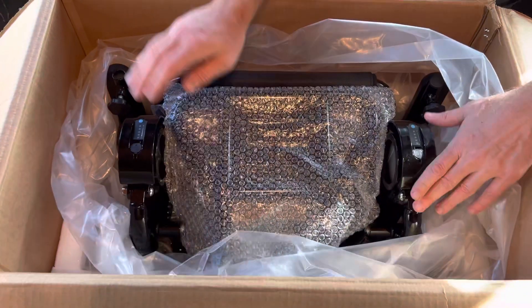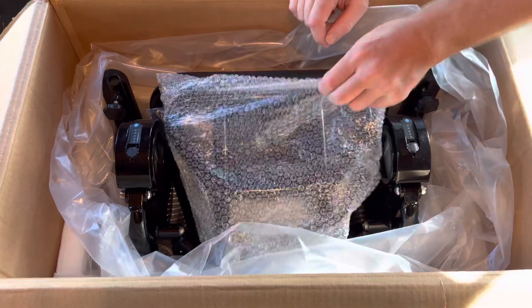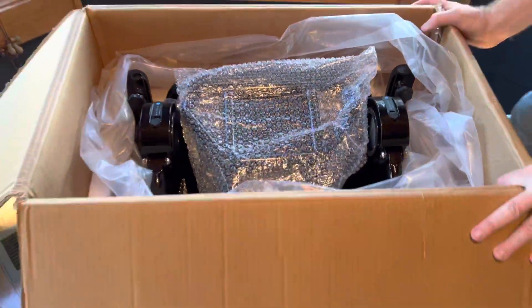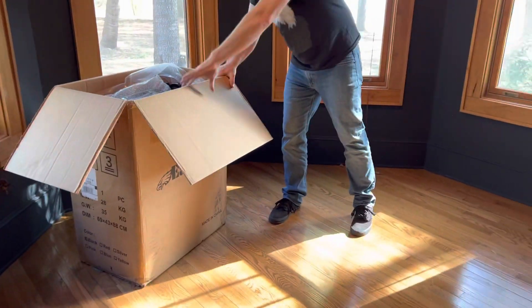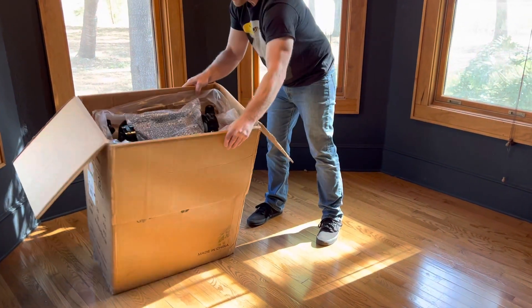The next thing you can see is that we have two in-frame batteries right here. We've got bubble wrap on the footrest. What I'm going to do here — I'm not going to try to just lift it out of the box — I'm going to kind of turn this so the footrest faces up.